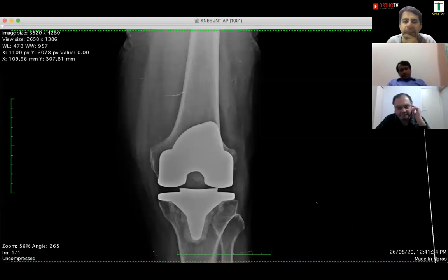Can you see the screen still, or did I stop? Yeah, it stopped. Just a minute. Let me show you now. Now see this. This is the one. This is the recently done knee. You can make out this is Attune. Yes, correct.